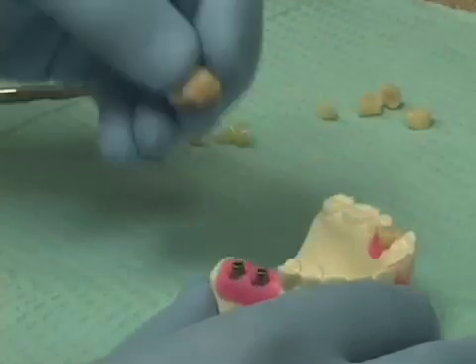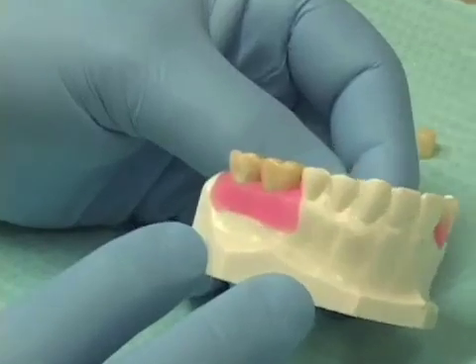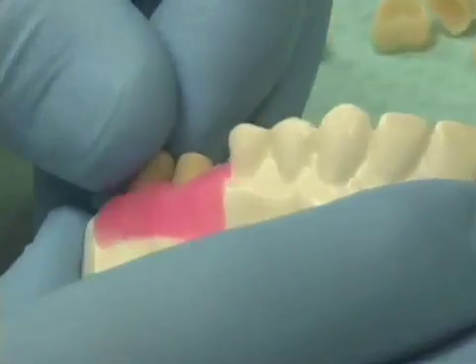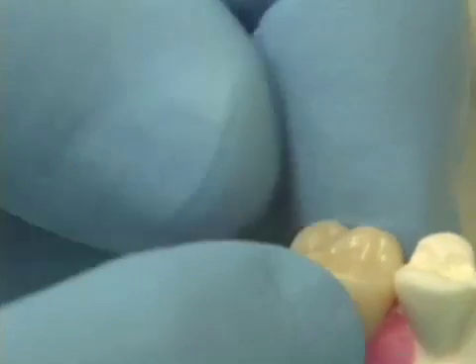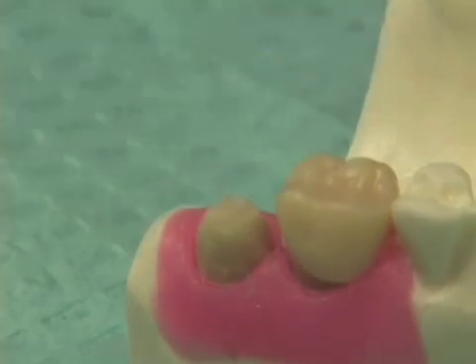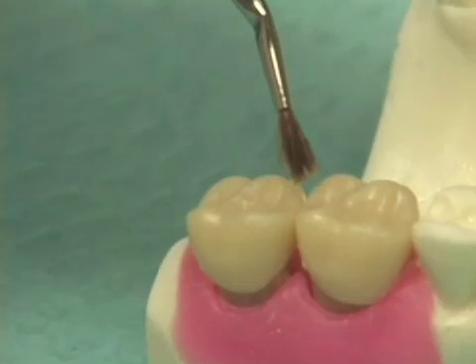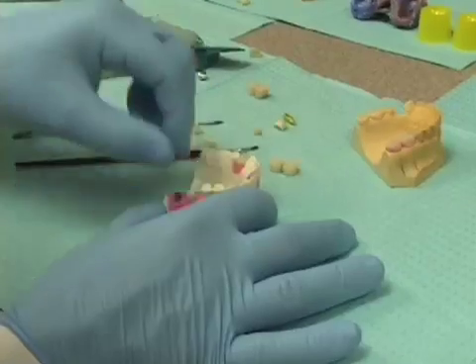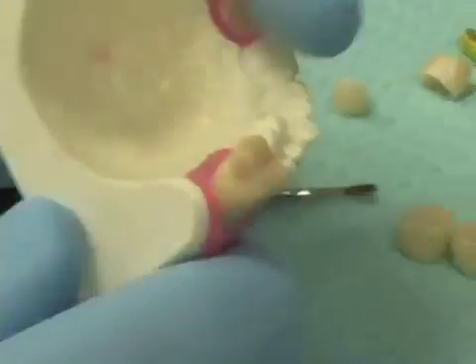We have an example of a completed provisional — a splinted provisional that would go in place where we have two adjacent implants in the posterior region. If one had made the individual teeth using the aluminum shell crown form, pouring acrylic into the aluminum shell crown form, one would do a similar technique: hollow out the tooth, fit it over the coping, and lute them together. Then go ahead and lute the second one over the second coping, and very easily come back with acrylic to join the two together. When it's all done, we want our patient to have a nice provisional restoration that will help sculpt or form the gingival contours for our final crown.